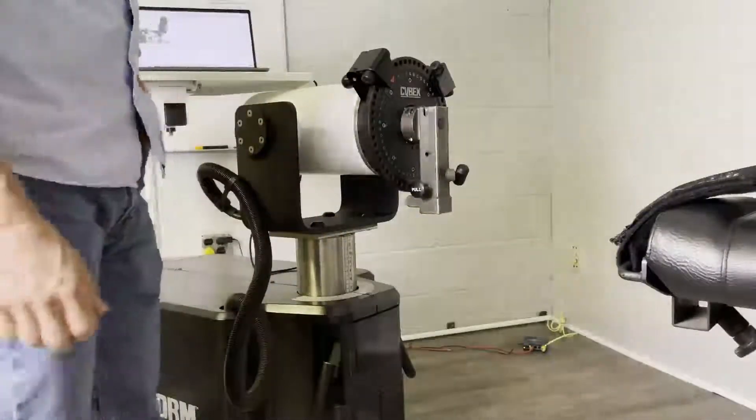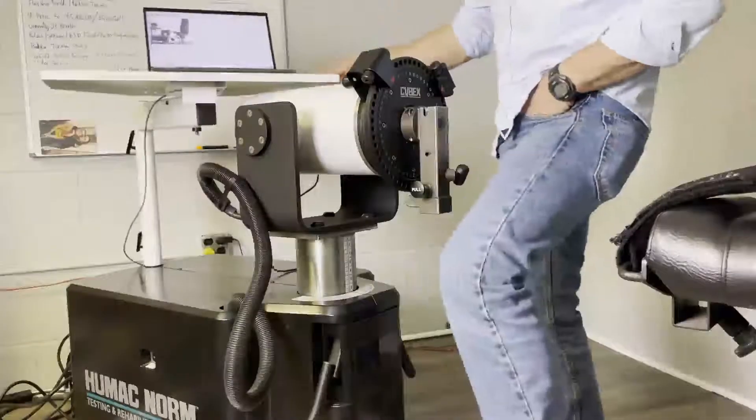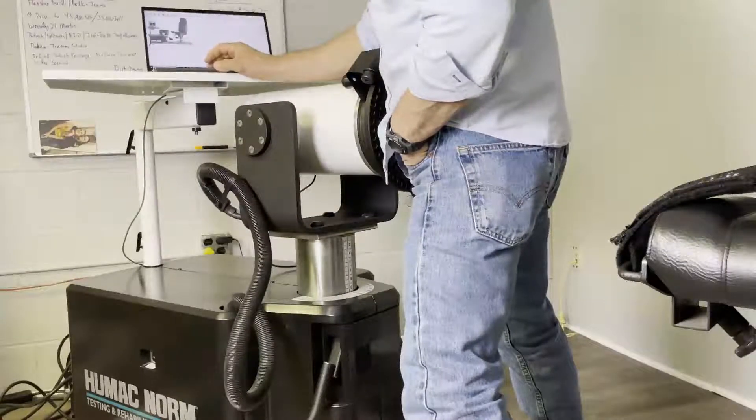I'm going to take you through how to calibrate the Humac system. On the main screen, you're going to pick utilities, then calibration.